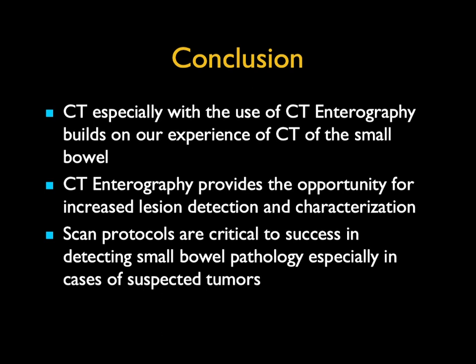Again, scan protocols are critical. Post-processing is critical, and recognizing how lesions look, what their classic appearance is, is not always going to make you right, but you're going to be right most of the time. And with that, I hope you enjoyed this 3-part series on small bowel tumors.